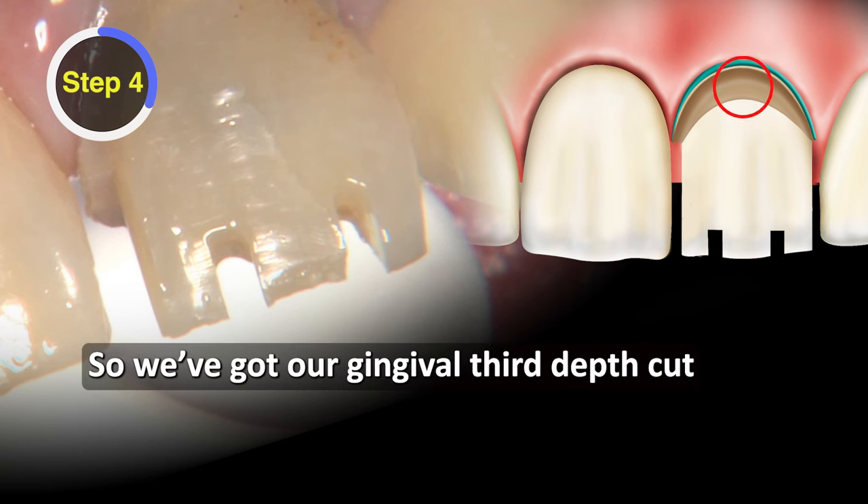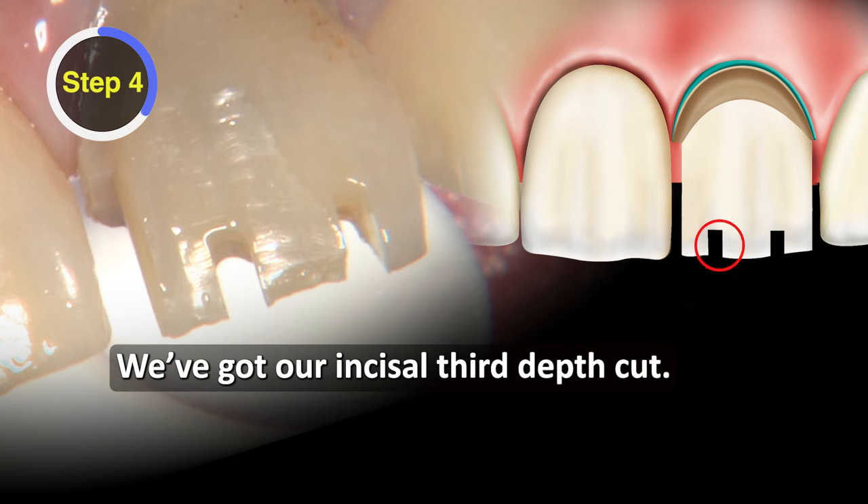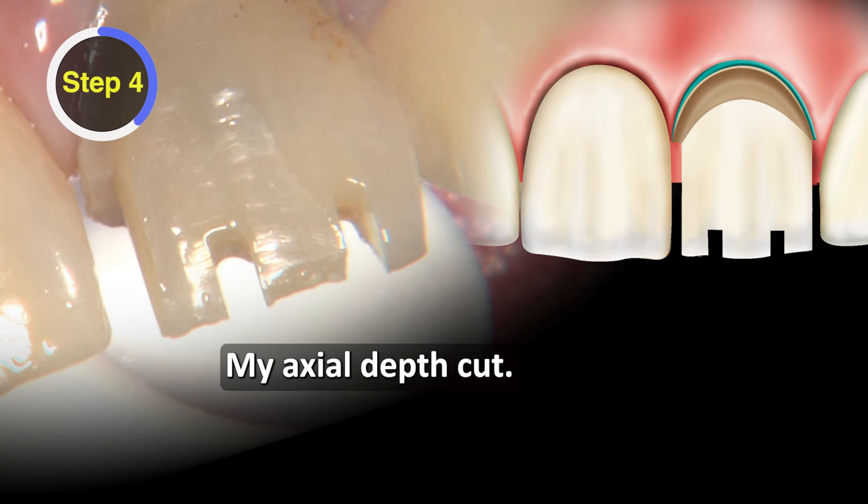We've got our gingival third depth cut, we've got our incisal third depth cut, and now I need one more depth cut — my axial depth cut.